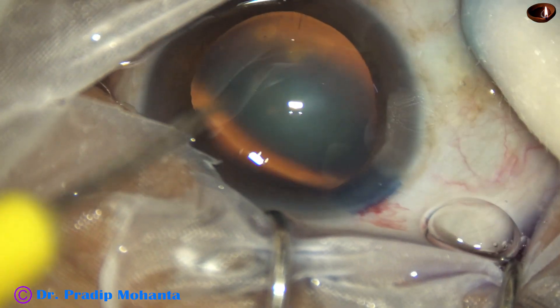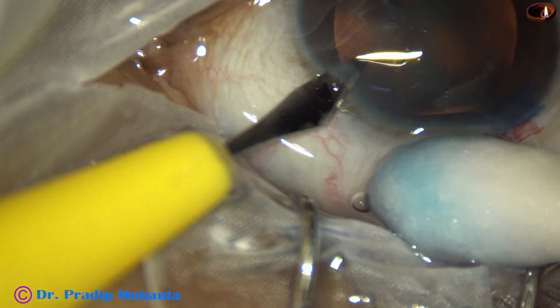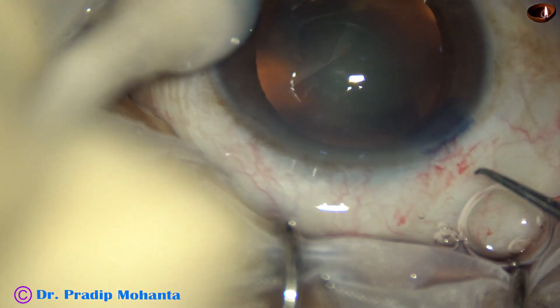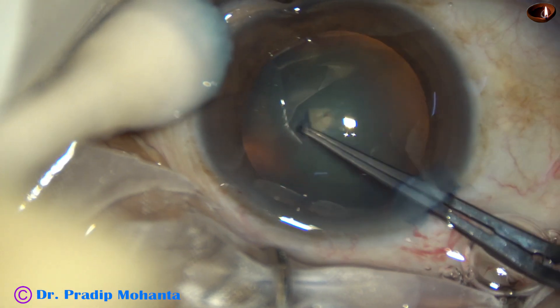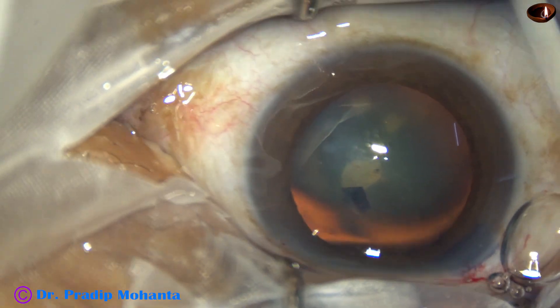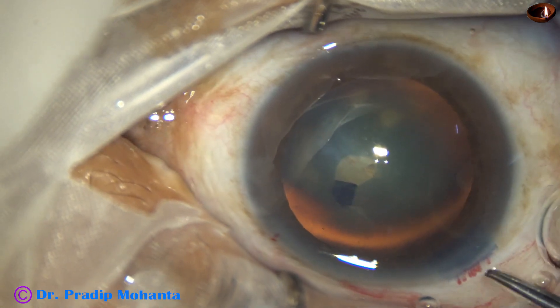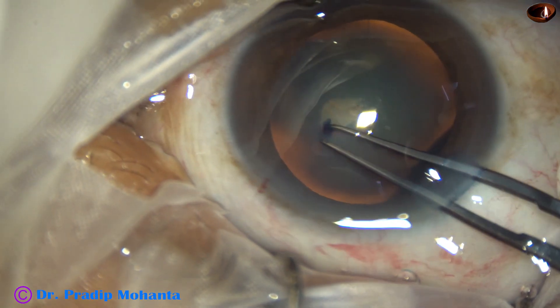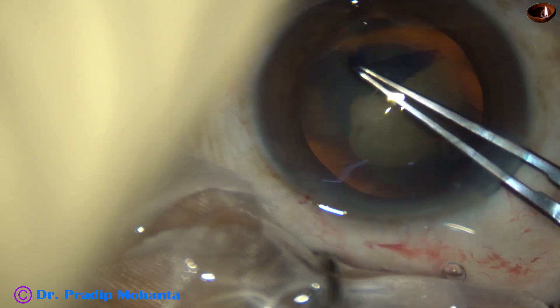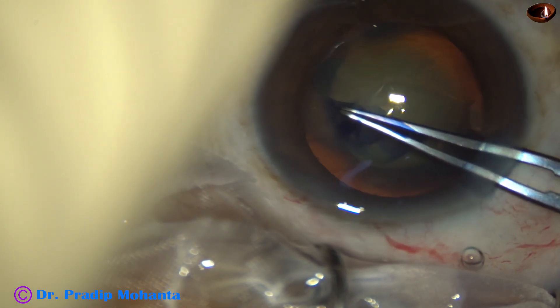A side port is made on the left side of the main incision, about 3 clock hours away. After making the side port, capsulorhexis is being done with the help of Utrata forceps. The capsular tag is raised by the tip of Utrata forceps, and if the anterior chamber becomes shallow, you just have to refill the anterior chamber. The capsular tag is guided anti-clockwise all around to get an adequately sized capsulorhexis.